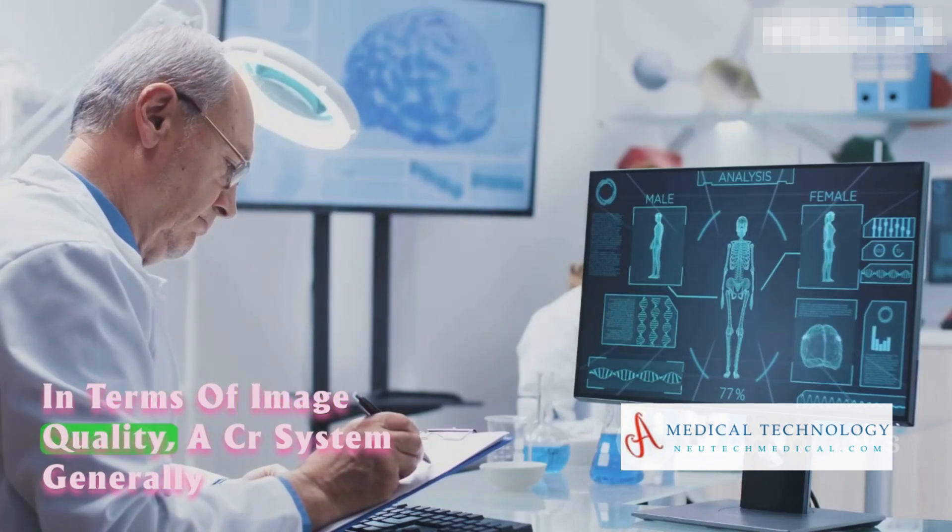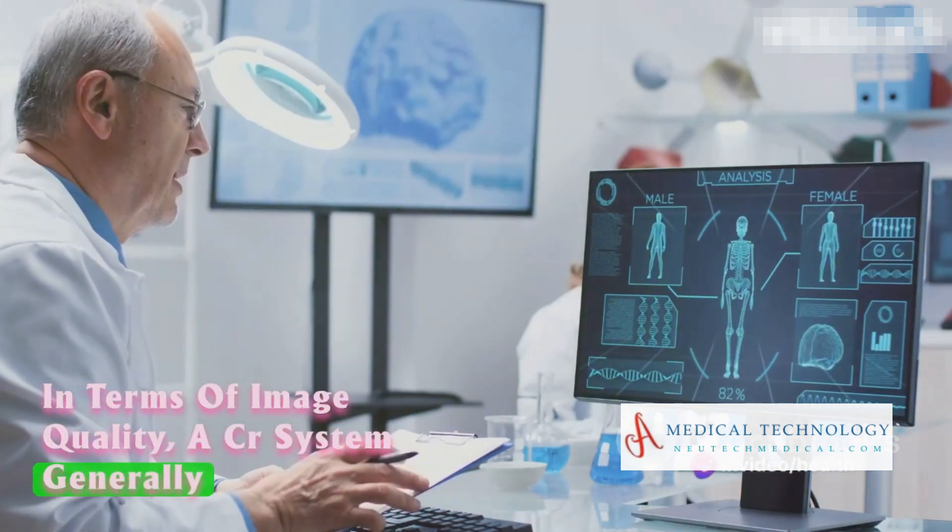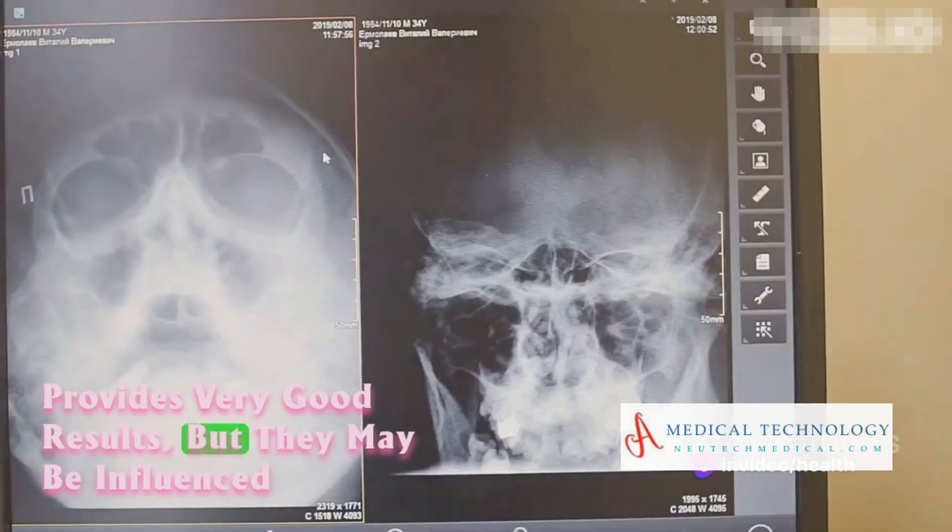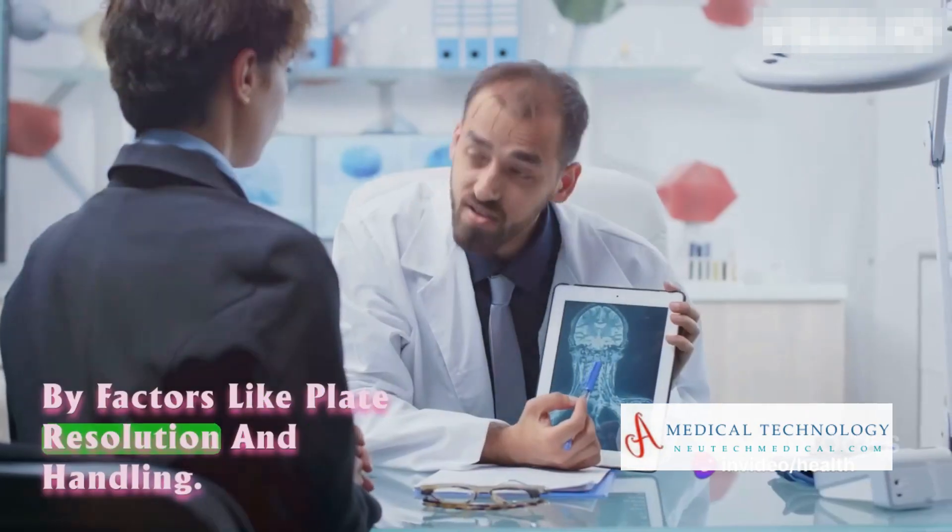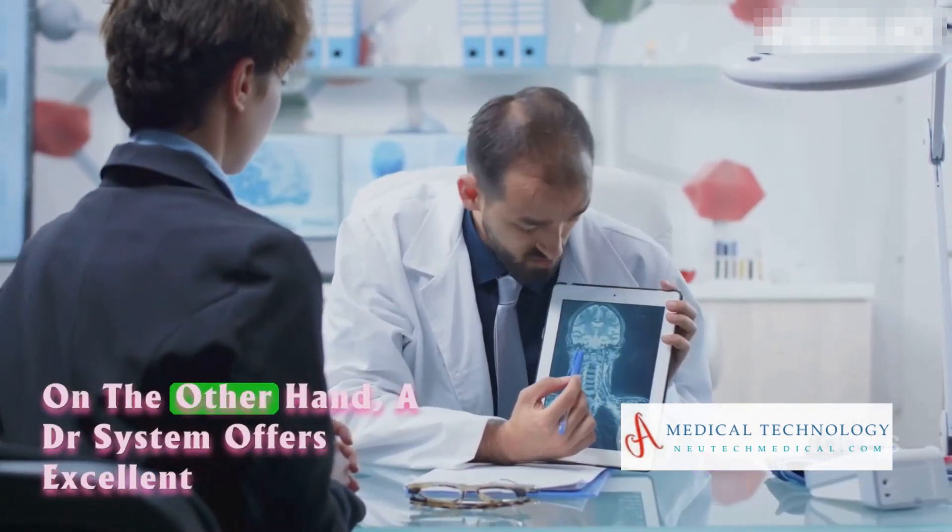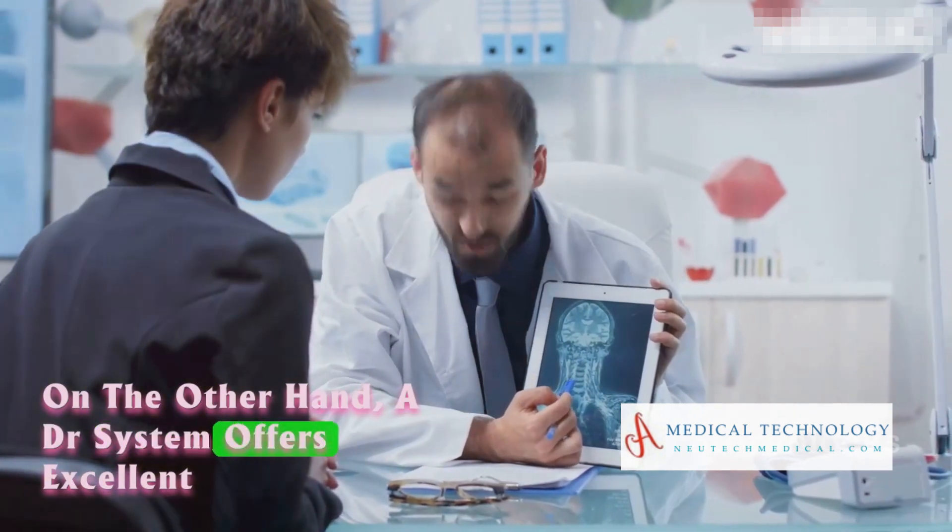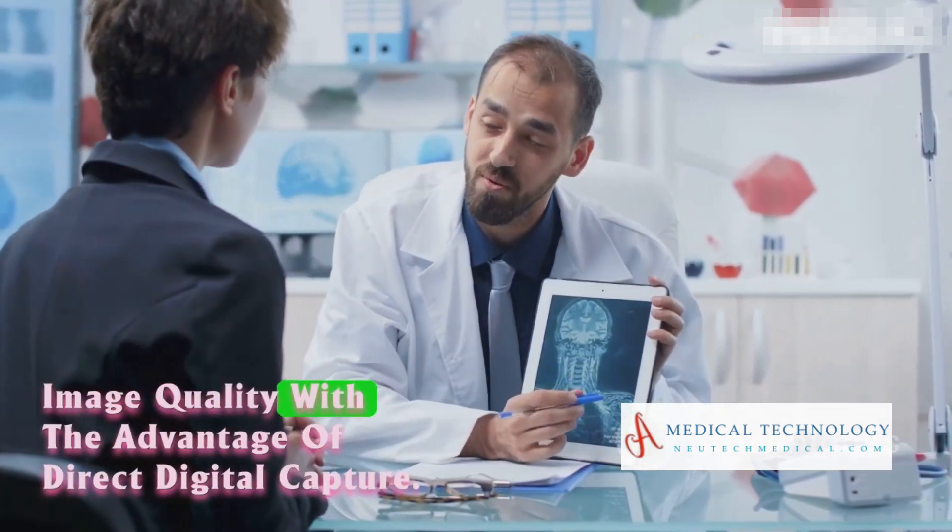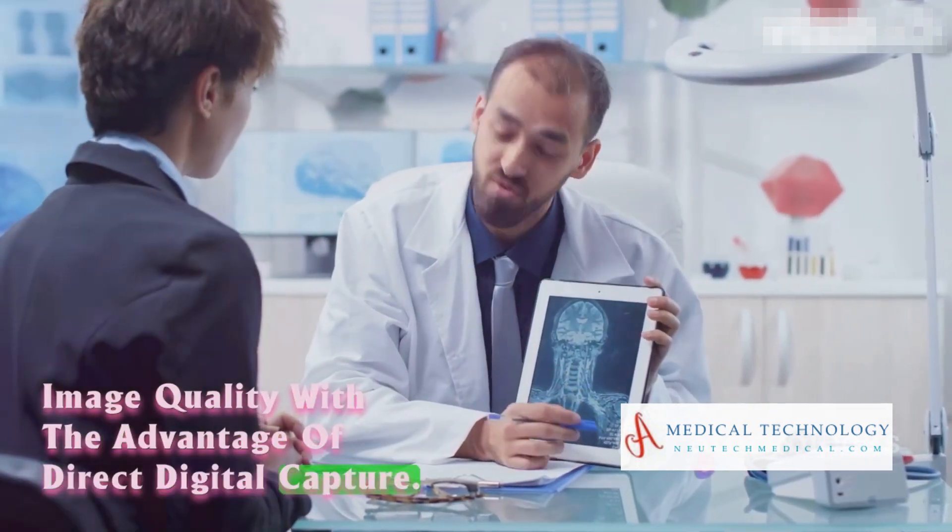In terms of image quality, a CR system generally provides very good results, but they may be influenced by factors like plate resolution and handling. On the other hand, a DR system offers excellent image quality with the advantage of direct digital capture.